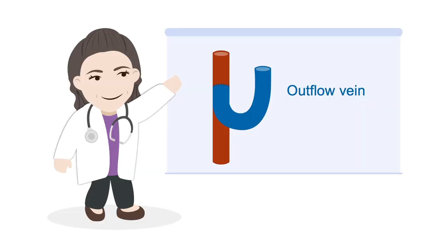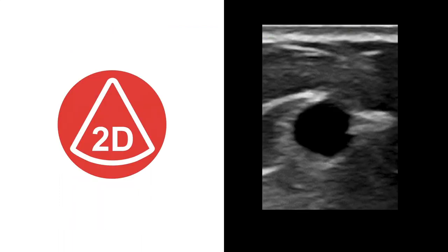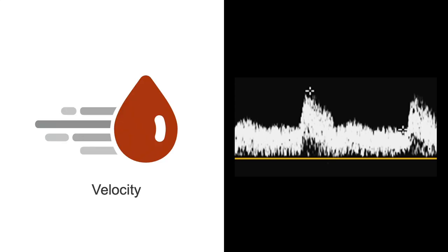Next, you should evaluate the outflow vein using 2D to obtain the diameter and depth, as well as Doppler waveforms to obtain velocity measurements.